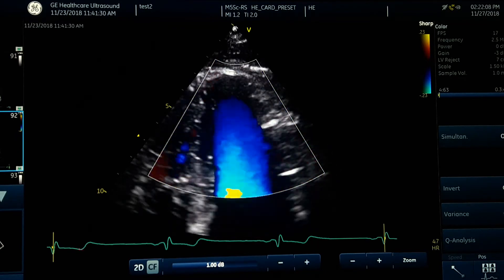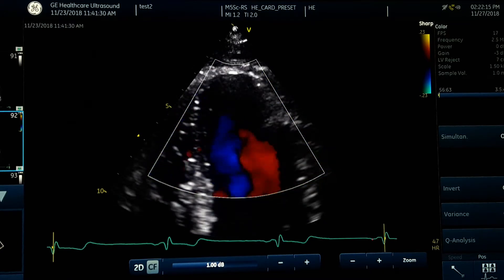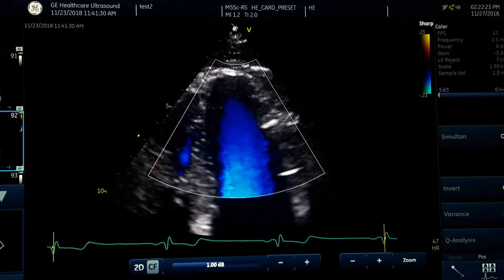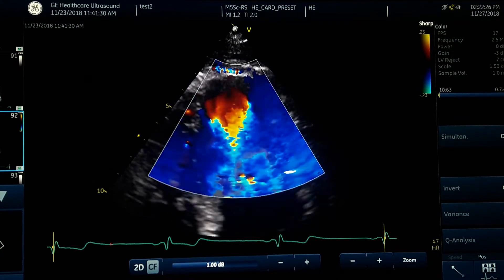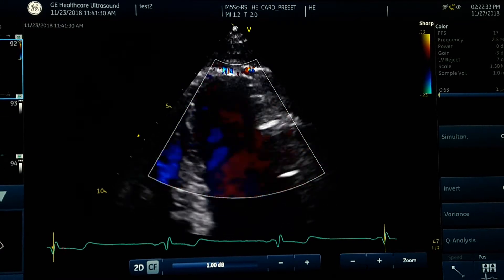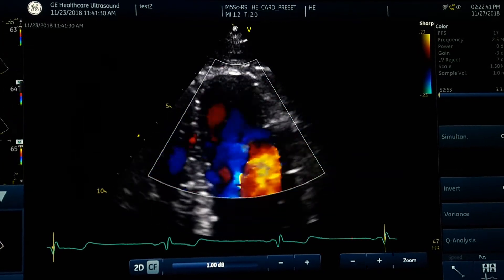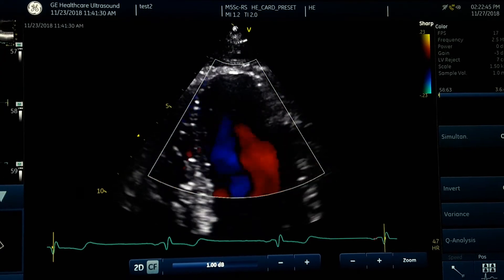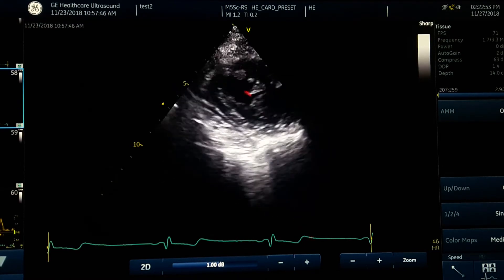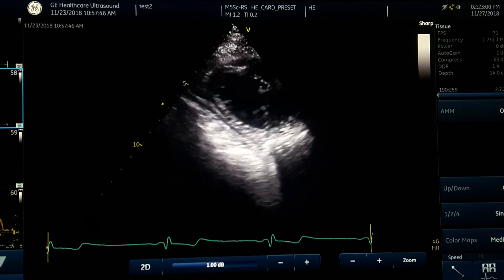You should perform all these steps in the apical 2-chamber and apical 3-chamber views, both on-axis and off-axis. If you can see the finding in most of those images and the characteristics match, that confirms your finding. As the last step, always go to the short-axis view at the apex level — this often helps clarify things. If the apex contracts well and is free, you can rule out thrombosis or mass and conclude it was an artifact.